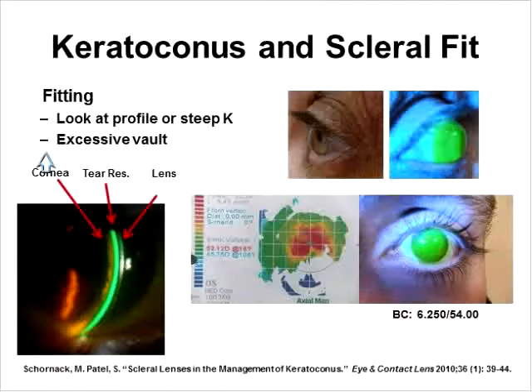If you have a patient that is progressing, consider fitting the scleral lens with excessive vault. In other words, consider leaving extra room for the progressing condition. Compare the cornea, which is about 500 microns, to the posterior reservoir. A posterior fluid of about 150 microns to 400 microns is acceptable. So you may want to vault the cornea up to about 400 microns.